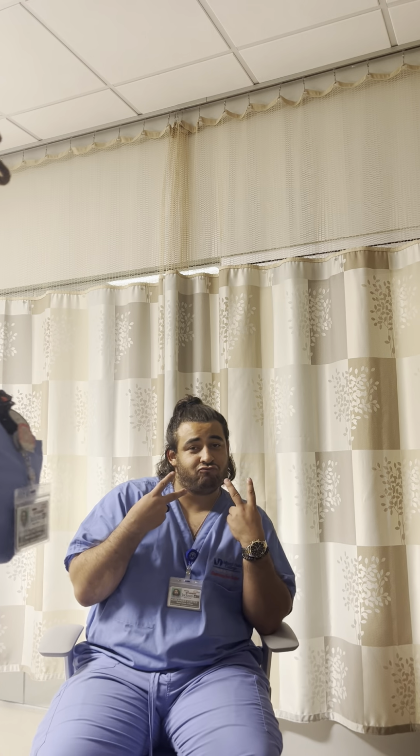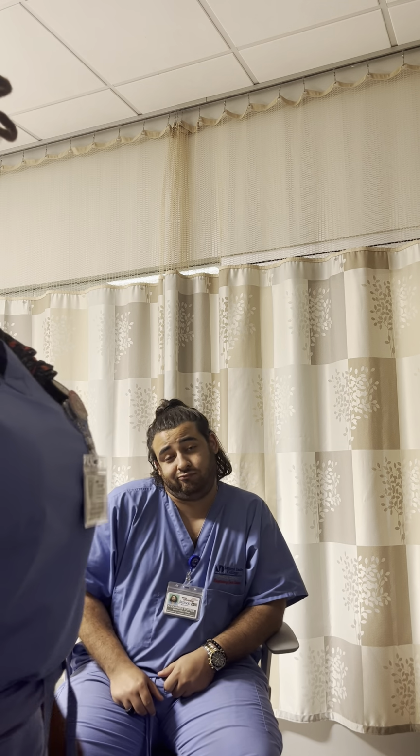Okay. All right. Hello. This is CORTEZ, and we're doing the IS spirometry walkthrough. So today we're going to be, like I said, doing an IS video.